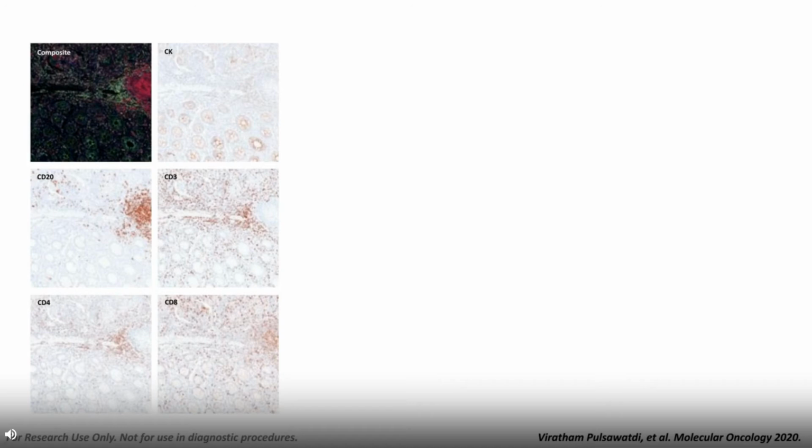And as you can see here, if we look more closely, our CD20 has some overlap into the CD8 channel. Our cytokeratin has some overlap into our CD4 and CD8 channels. And this CD20, CD8 relationship is due to a thing called spectral bleed through. Both of these antibodies use two spectral dyes which are very close in range. So by changing the two different dyes used, we're able to better spectrally separate and not have this bleed through in later iterations of the staining process.